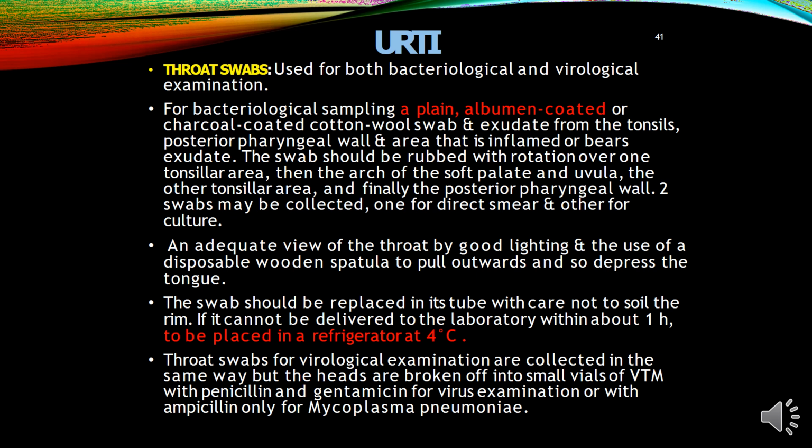Throat swabs for virological examination are collected in the same way, but the head is broken into a small vial of VTM with penicillin and gentamicin for virus examination, or with ampicillin only for Mycoplasma pneumoniae.